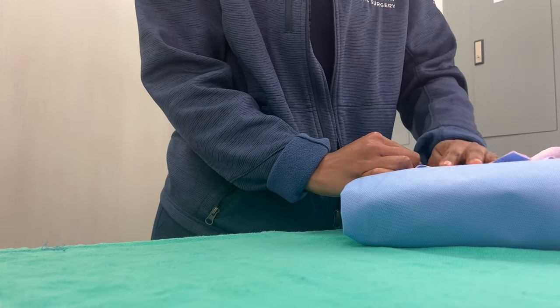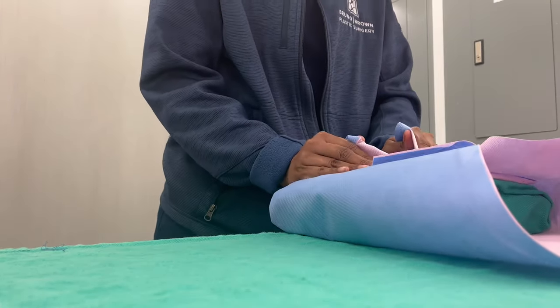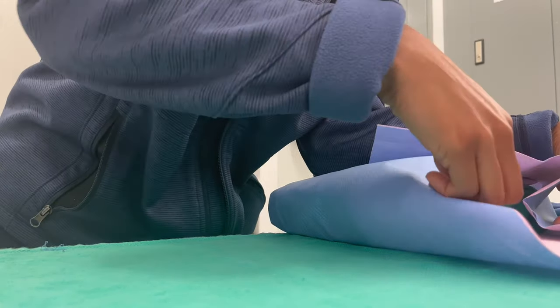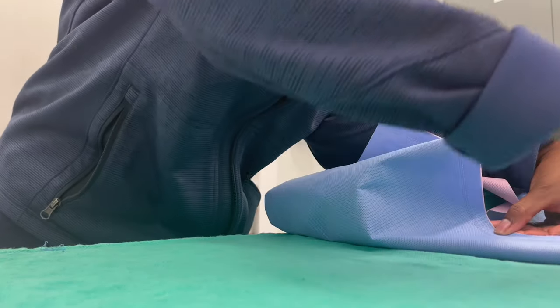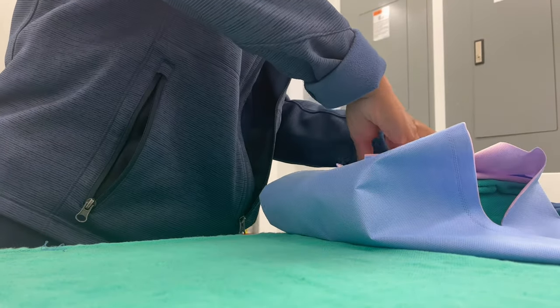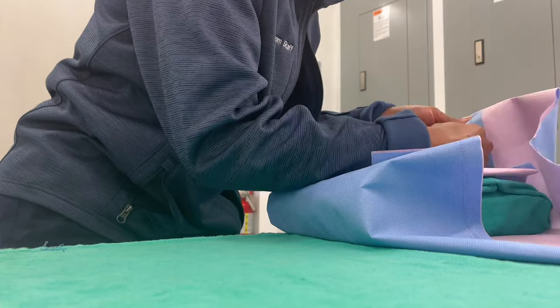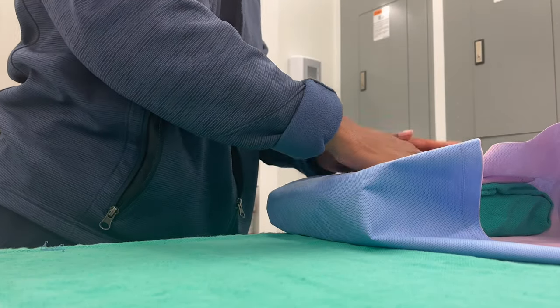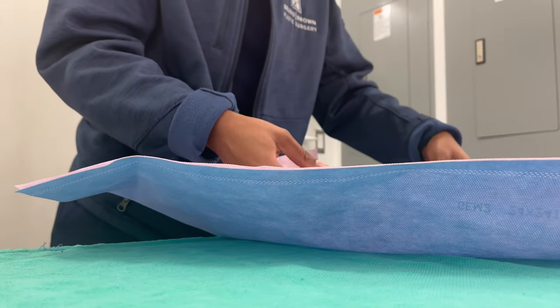But the biggest thing is just making sure that it is tight. You don't want any air gaps in there. So you want to have it as tight as possible, even if that means you have to play around with it. And you guys will see, I fight with this a lot, just to get it perfect the way I want it. So I'll open it back out and redo it a couple times just to make sure it's going to be wrapped properly and there's no gaps in there for a potential fire or something inside the autoclave.